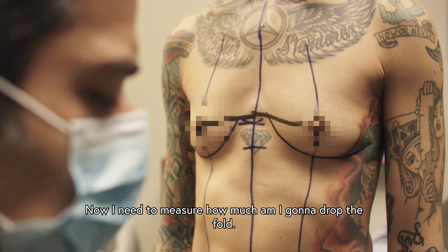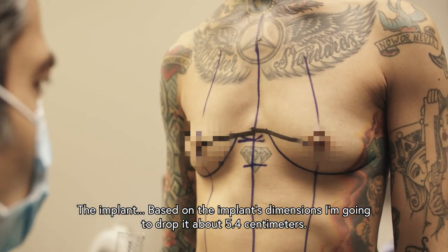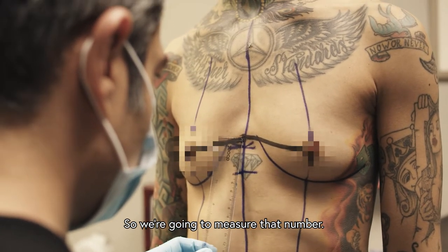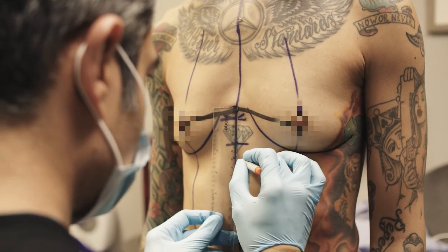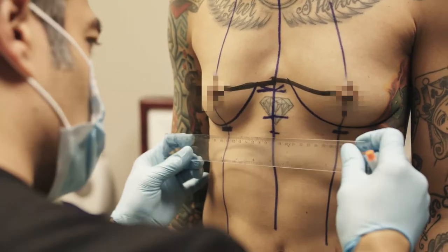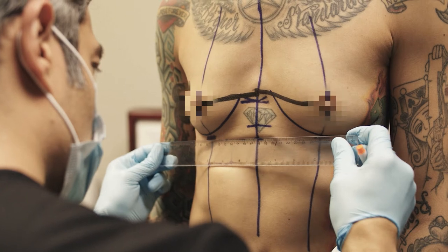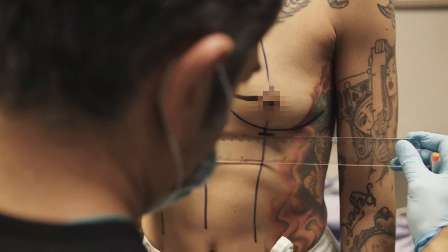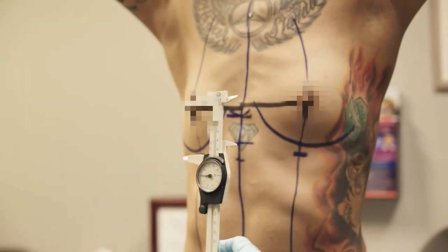Ruler. Now I need to measure how much I'm going to drop the fold. Based on the implant's dimensions, I want to drop it about 5.4 centimeters. So I'm going to measure that number. They're going to be close, but a little bit different on each side. Give me that Y one more time.